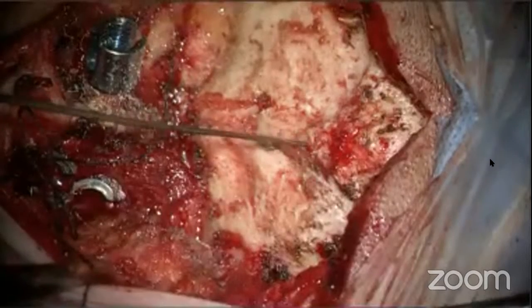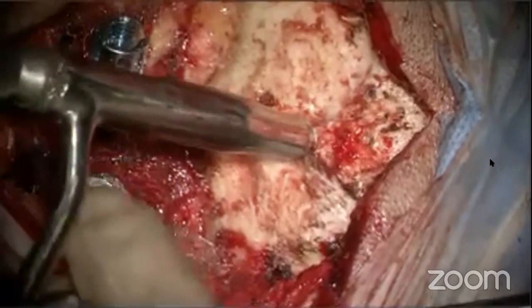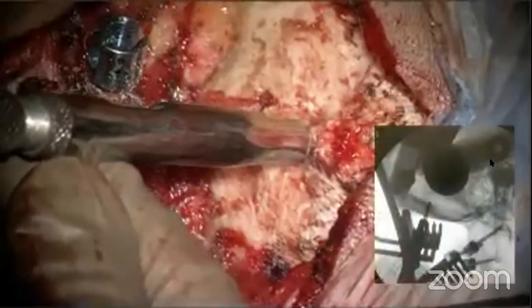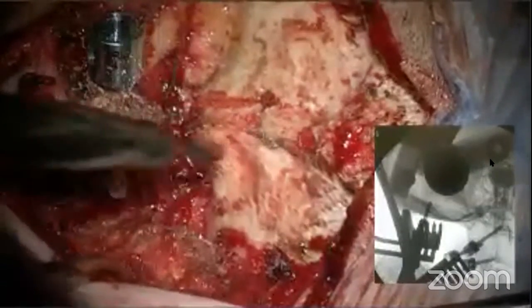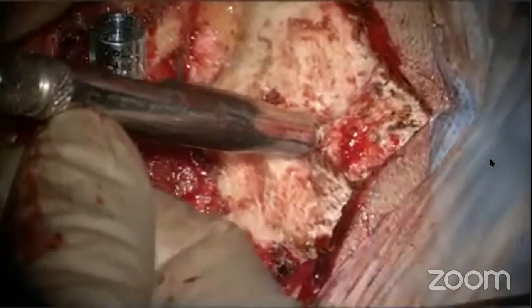After every pass, the hole is checked with a ball tip feeler. If the inner table is intact, the drill stop is increased by 2 mm. Generally, in the midline, we have to increase this a couple of times to approximately 10 to 12 mm to break into the inner table. We recommend doing this in a stepwise manner to prevent inadvertent injury to the dura or other vital structures.